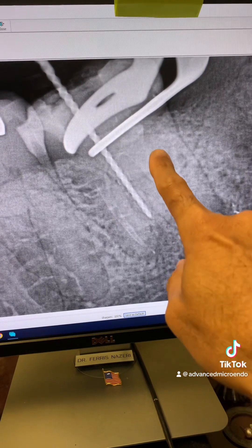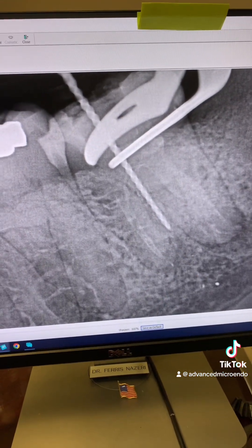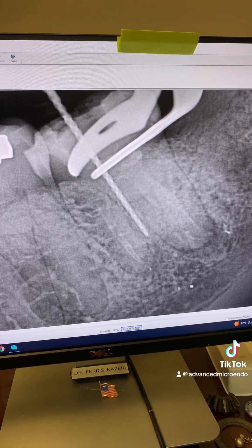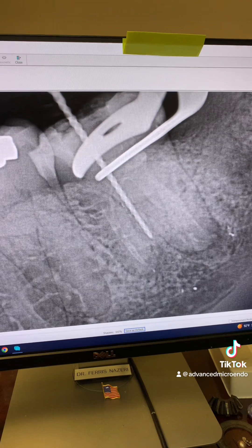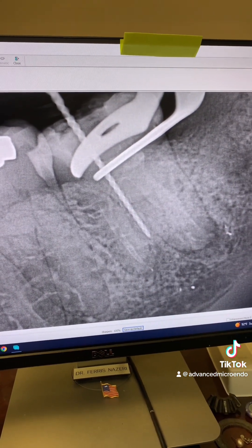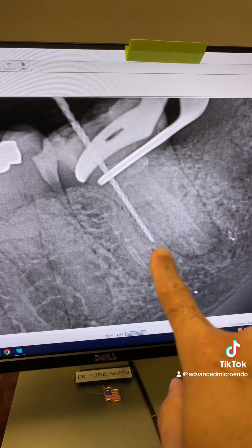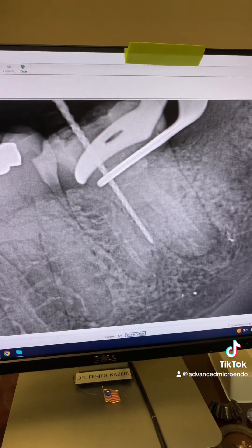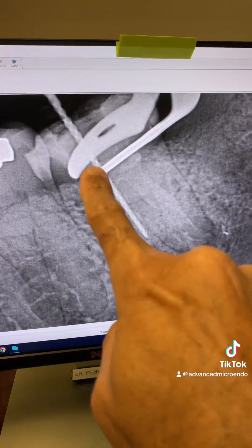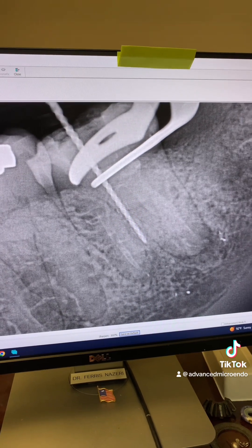To confirm the working length of the mesio-lingual canal, because my apex locator was telling me it was 15, we went ahead and did a working-length PA. You can see that the apex locator was correct — the working length was indeed 15 and a half millimeters.